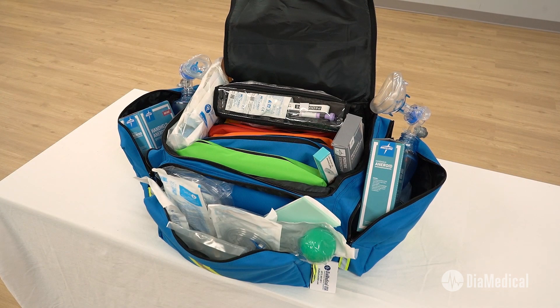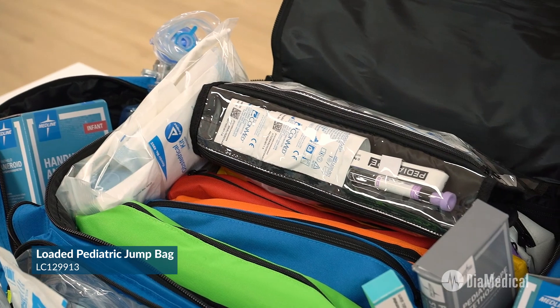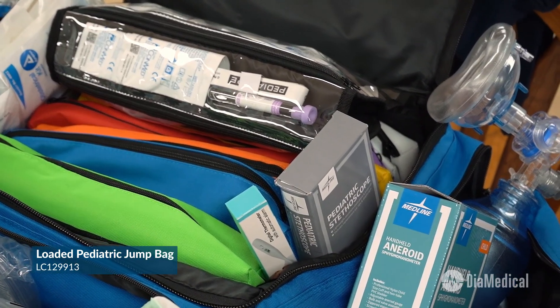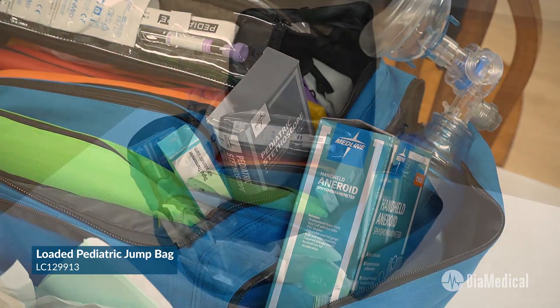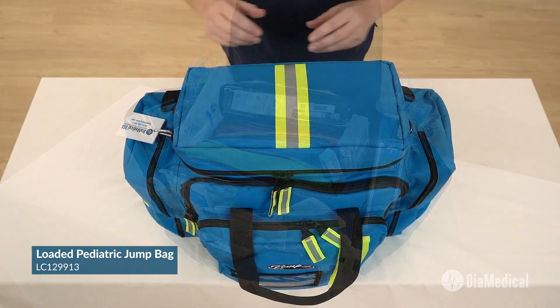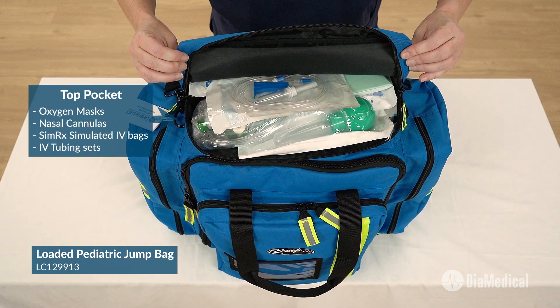The SimLab Solutions Loaded Training Pediatric Jump Bag is designed to carry all of the essential supplies for treating children in emergency situations. It seamlessly organizes pediatric trauma supplies according to the Broselow system. The top pocket contains masks and nasal cannulas for oxygen administration. It also includes SimRx simulated IV bags and IV tubing sets.